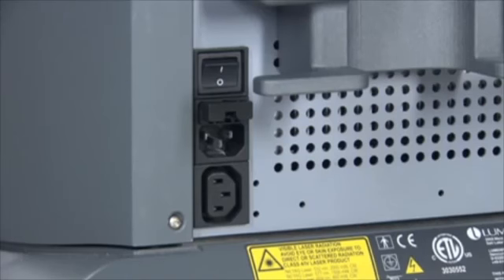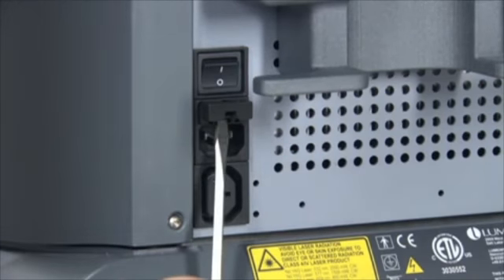Locate the fuse holder directly above the main power receptacle. Unlock and pull out the fuse holder by inserting a small insulated flathead screwdriver into the slot on the fuse holder cover.